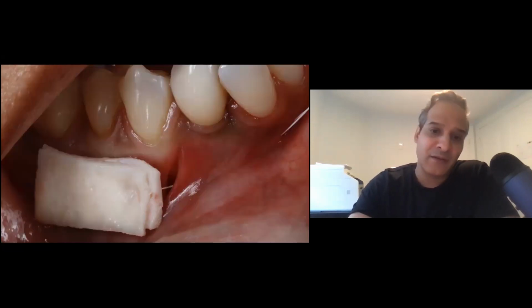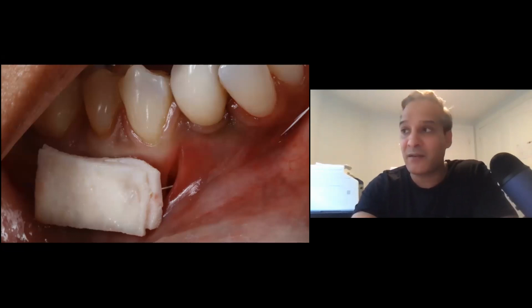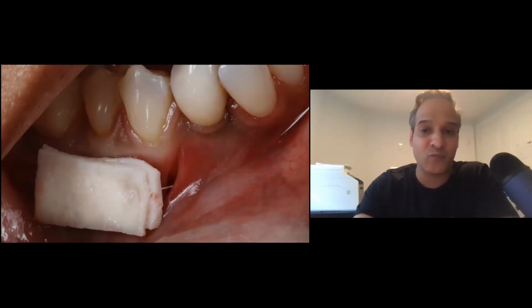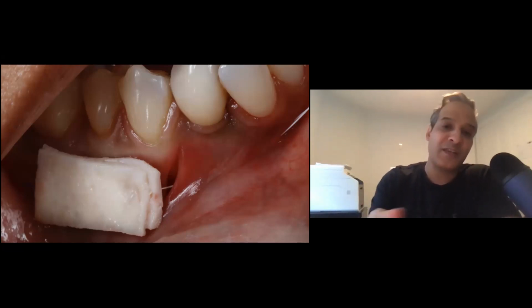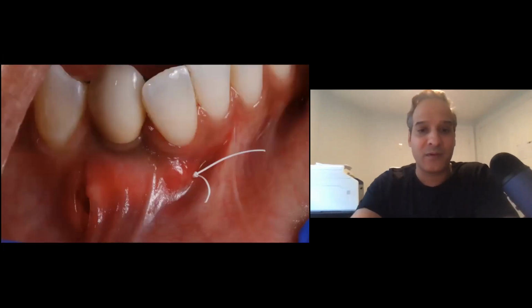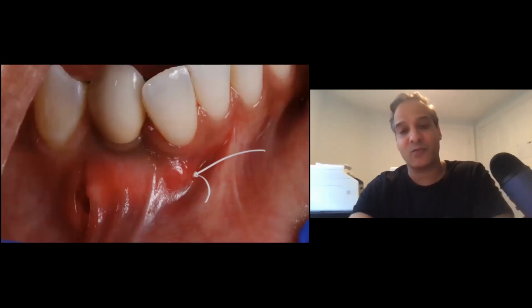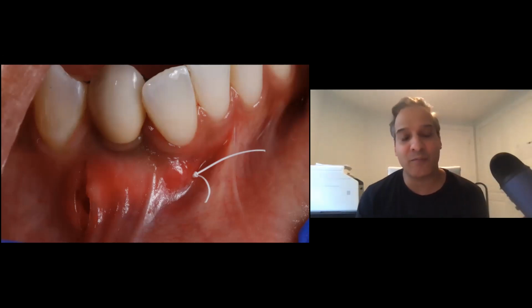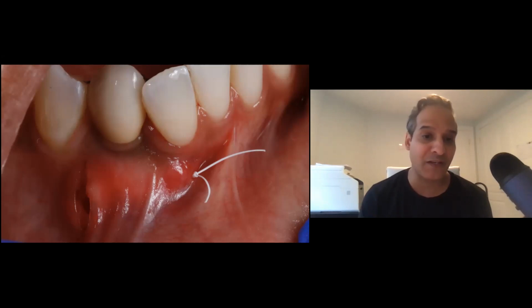And then you can see here, so Azim, you're wondering how I do the suture. Here, the needle goes into the tissue from the flap on the mesial. It comes out of the incision line. It grabs onto the actual graft itself, and it goes back into the incision line, and comes out of the same side of the buccal flap where I entered. And then you take the sutures and you pull the graft through. Then it just ties out of the same place. So we just tie the knot. This is what we call a purse string suture. It basically allows you to pull the graft into the flap where you need it to.